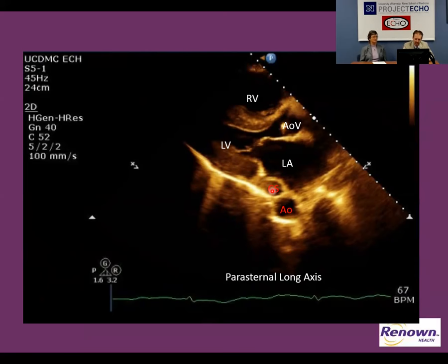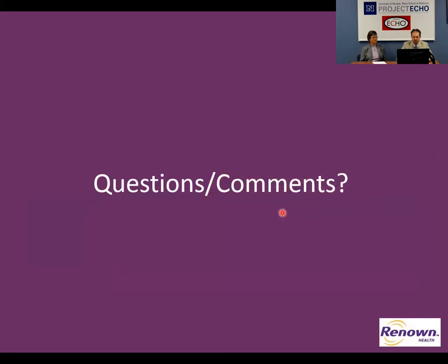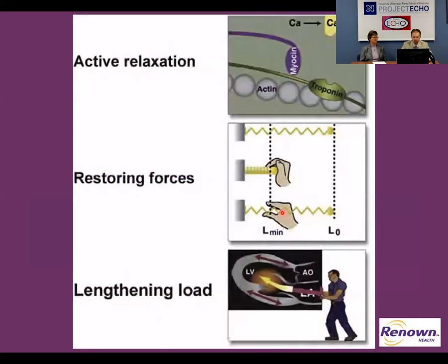And then the descending aorta is outside of the pericardial reflection, and that's how you tell that. And so this person actually ended up having a persistent left superior vena cava, which only affects pacemaker implantation and a few other things.